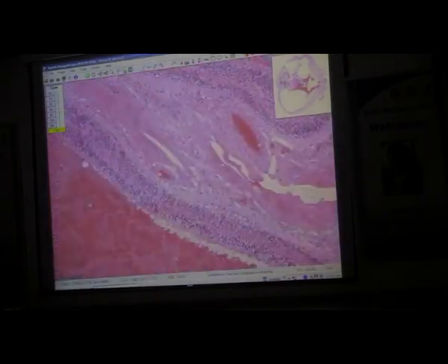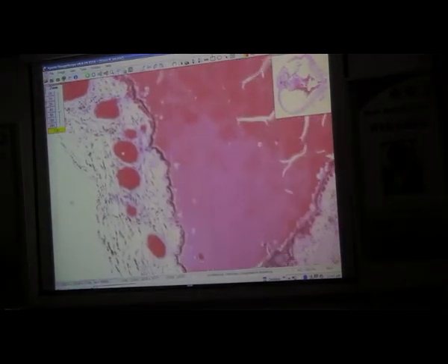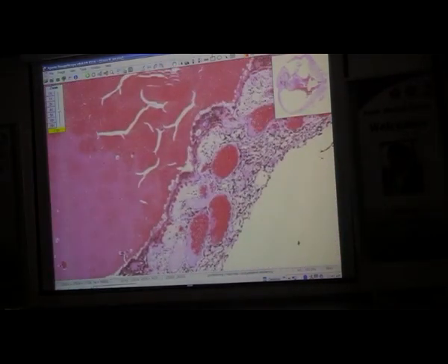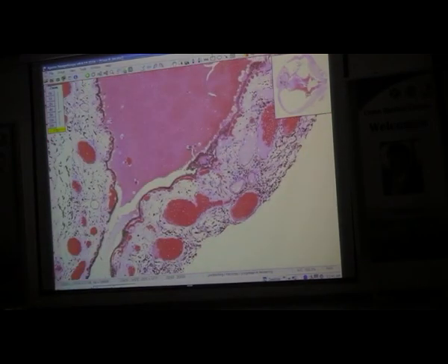I want to show you and prove to you in another way that the intraocular pressure is low even before we see anything else. I'm going to show you some more evidence of a low intraocular pressure because if I look here at the choroid, look, it's not straight. Do you see the bumps in the choroid?